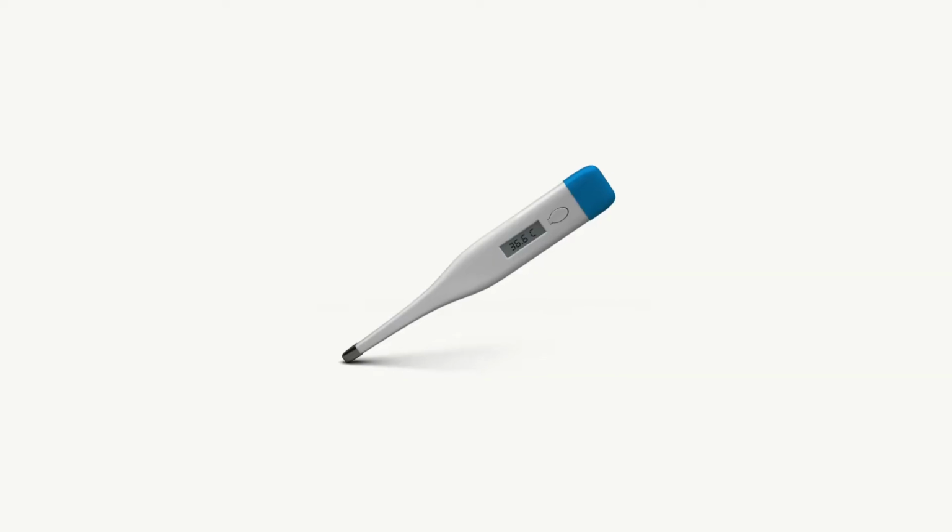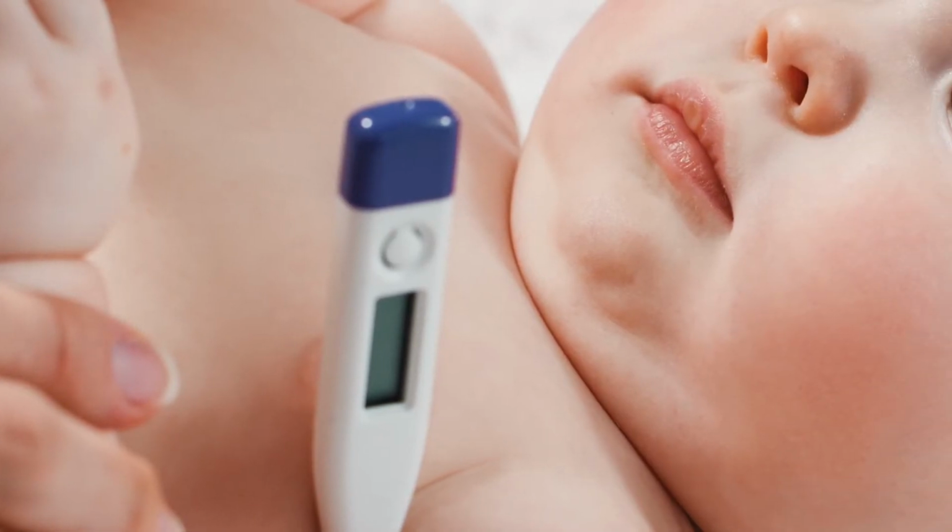And another 2 or 3 things are like if we have taken a high temperature liquid like hot tea, or if you have taken a very cold juice, something like that, or ice cream, then definitely it will affect the temperature measurement inside the mouth. The third preferred place is the axilla. The advantage is it's very easy.